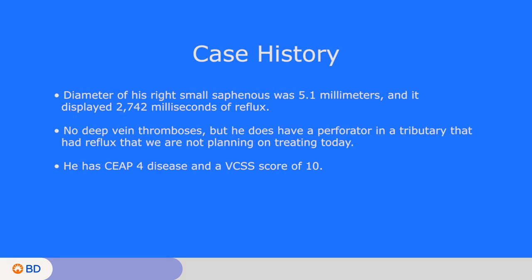On the ultrasound, the diameter of his right small saphenous was 5.1 millimeters and it displayed 2,742 milliseconds of reflux. He had no deep vein thromboses, and he did have a perforator and a tributary with reflux that we are not planning on treating today but have noted. He has C4 disease and a VCSS score of 10, and we will begin by touring you through the ultrasound anatomy.